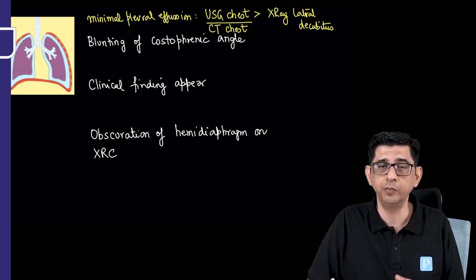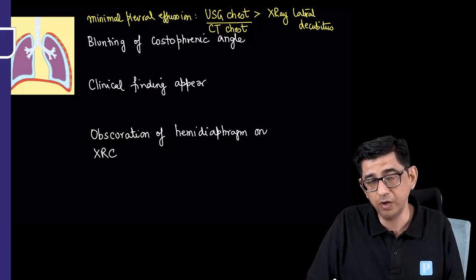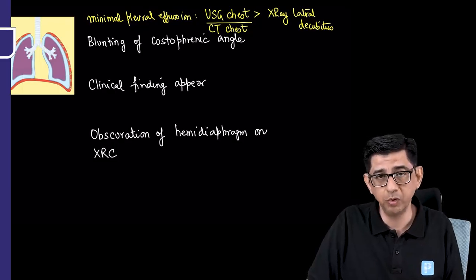But on the other hand, suppose in the casualty a patient has come and I want to evaluate whether this chap is having or not having a pleural effusion because he's having breathlessness, ultrasound chest would be more than sufficient.